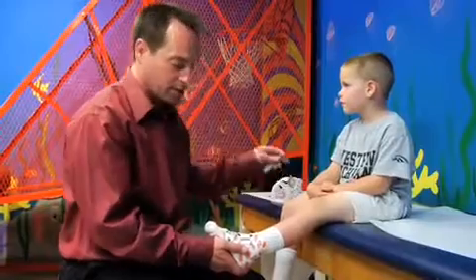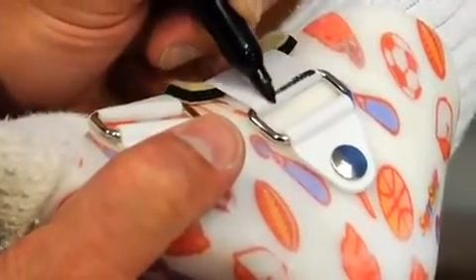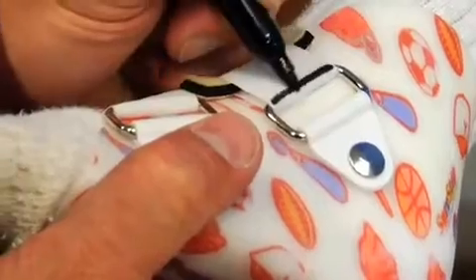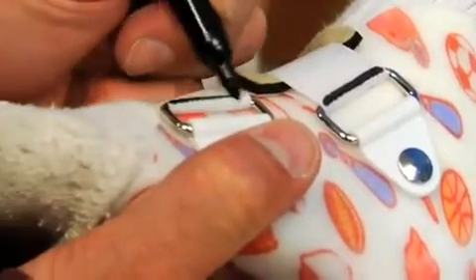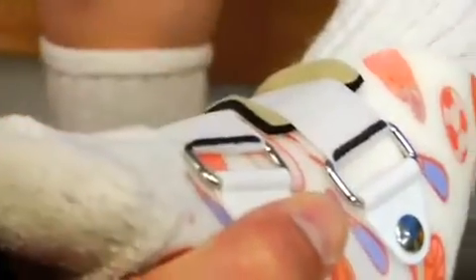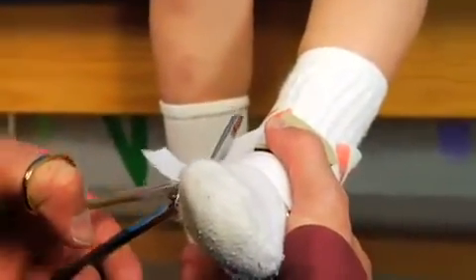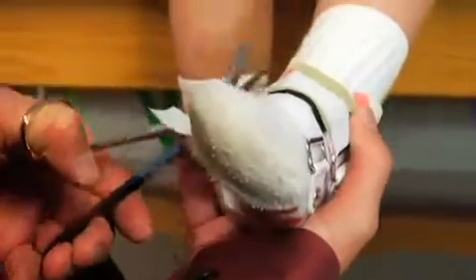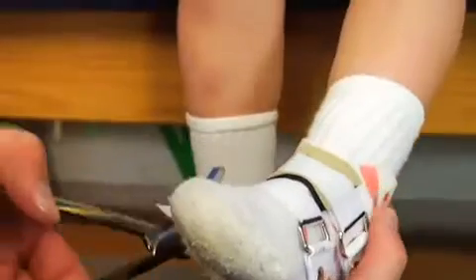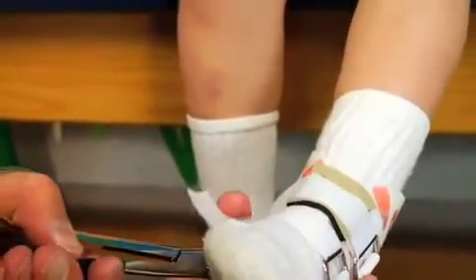The last thing we need to do is mark the straps and cut them. We'll mark the straps where they come through the chafing loop just to make sure they get put on to the correct tension every day. Finally, cut the excess strap off. This will help the SureStep get into a shoe a little easier and help parents make sure they're getting them to the proper tension.